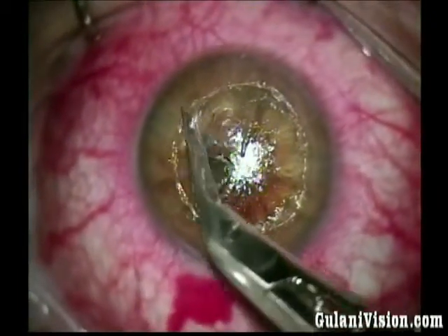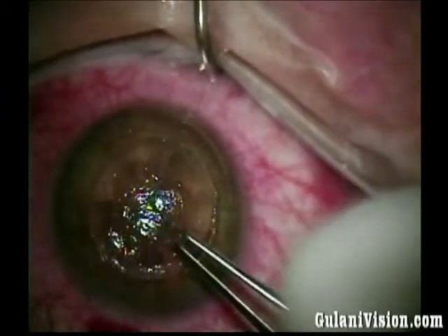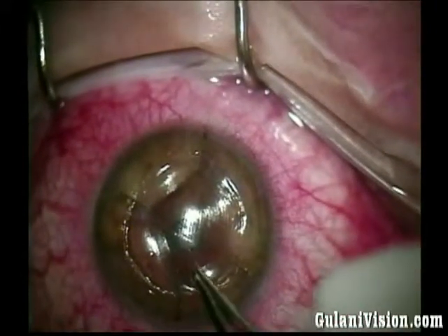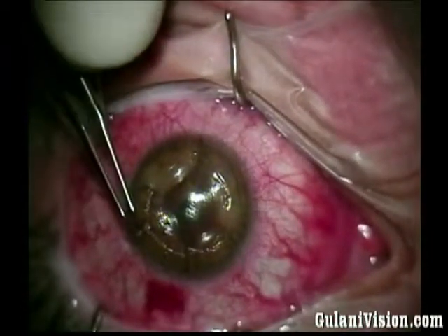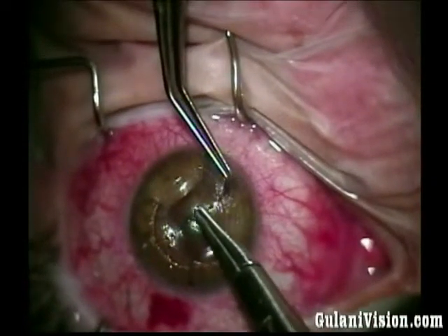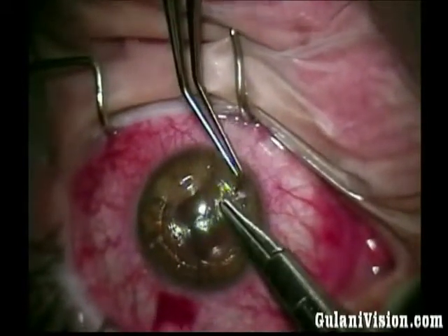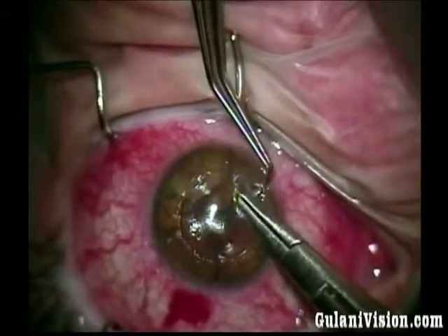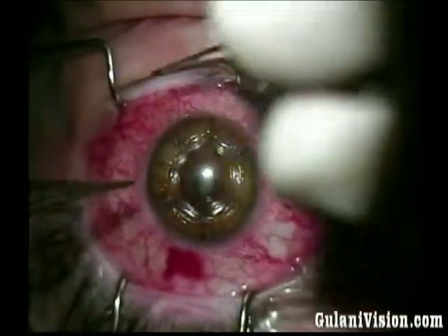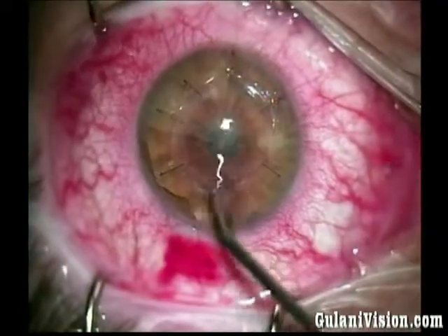This is the ectatic area with very deep incisions. I am now laying the donor tissue on the recipient bed, making sure it fits well. I proceed with anchor sutures — the problem here is I cannot go radial because of all these arcuate cuts everywhere, so I plan to go obliquely across and take two additional sutures to counterbalance the ectatic area. These sutures are mostly to compress the graft, decrease the ectasia, decrease the keratometry, and secure the graft in this very unstable cornea.